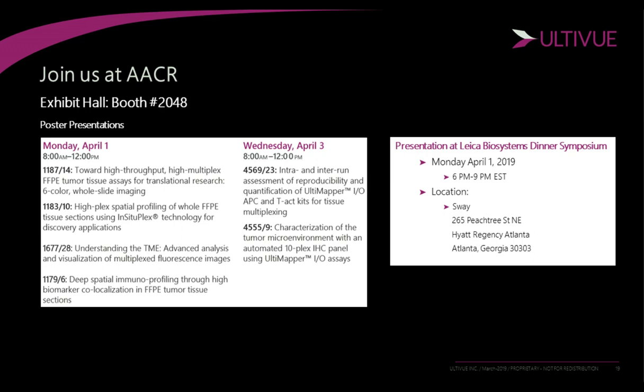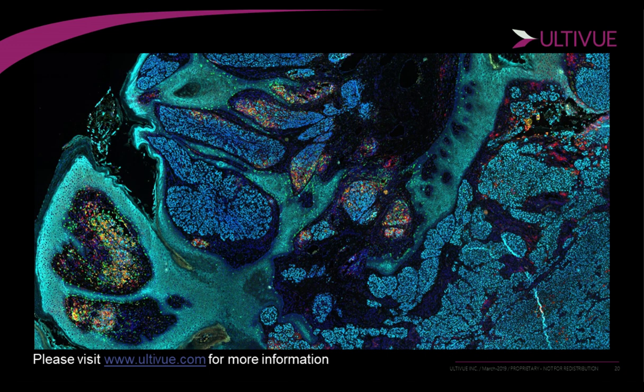And I'd like to leave you with one more image that I'd like to quickly discuss. It's something I didn't really highlight in the previous slides, just to save a little bit of confusion, but with some of our kits, you'll have noticed that we do a cocktail in our Cy7 channel, which is cytokeratin and SOX10. What we're looking at here is a cutaneous melanoma, where you can actually get 5-plex data out of one of our standard kits.